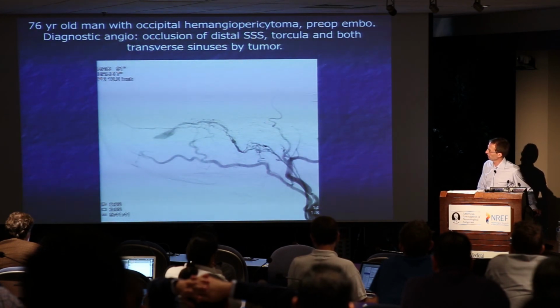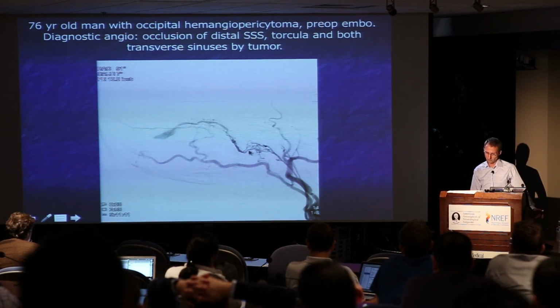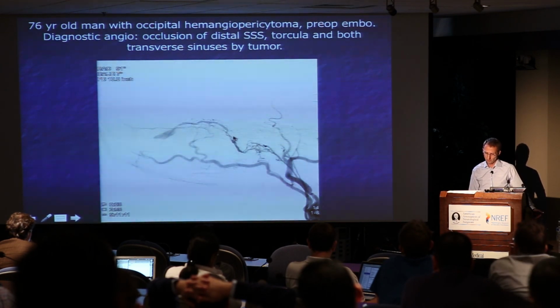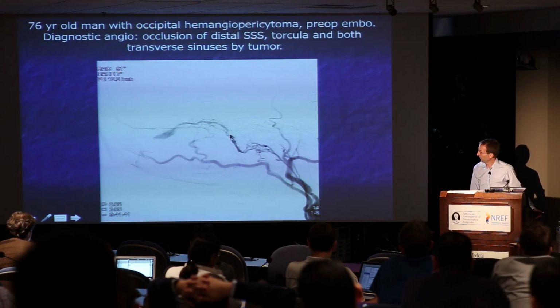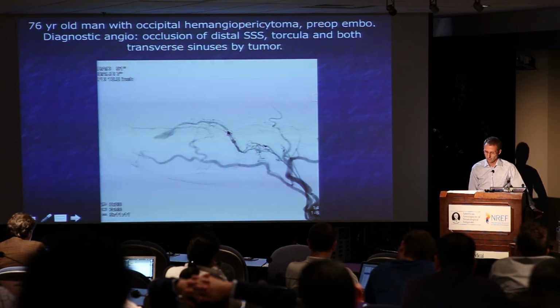And this gets back to the question you asked earlier. Initially, when I first saw this, I was wondering, well, is the fistula in here? Because there is this caliber change. But actually, if you look closely, you can tell these are arteries. Right there is a caliber change that you can see that this is a venous pouch. And actually, if you look up along through here, there are multiple tiny little vessels.